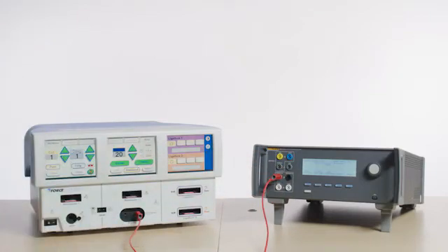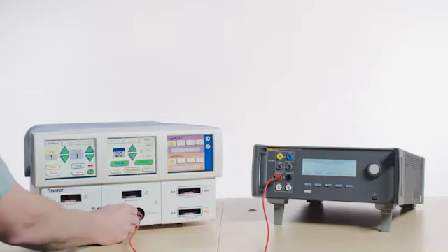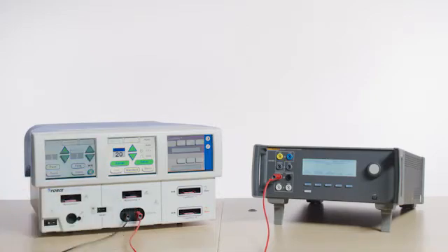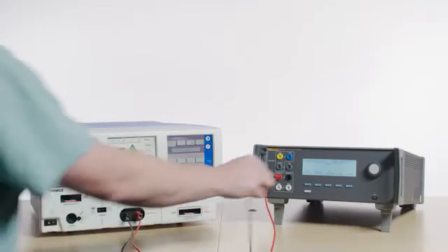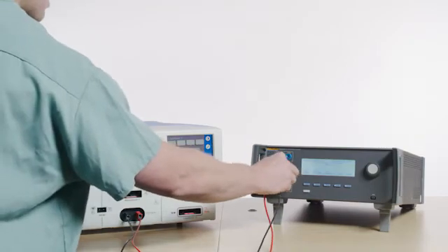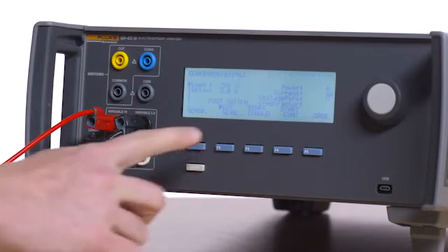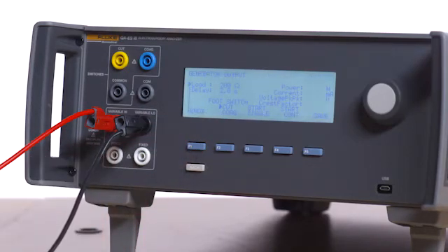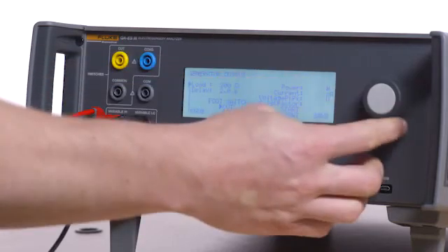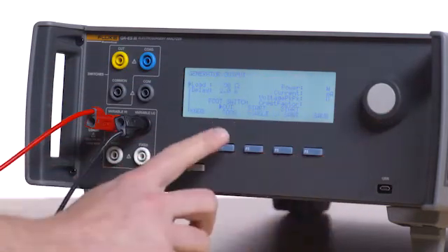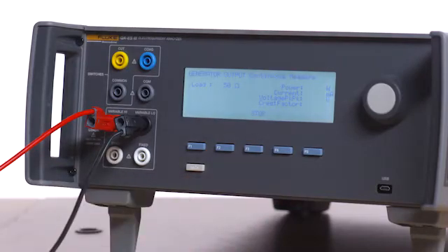Connect the opposite end of the red test lead to the variable high port on the QAES3. Connect the black test lead to the other jack on the bipolar port of the Force Triad, and the opposite end of the black test lead to the variable low on the QAES3. Press F1 on the QAES3 for generator output and select a 50 ohm load.